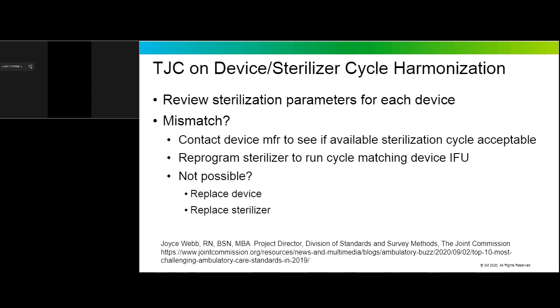So on that note, a word of advice, hopefully you're already very involved. If your clinic or surgery center is looking at buying new instruments, make sure you're in on that conversation, and that one of the considerations is, do we have the right equipment to be able to reprocess the device, to be able to clean it as recommended by the manufacturer, and to sterilize it according to the validated method of sterilization provided in the manufacturer's IFU.